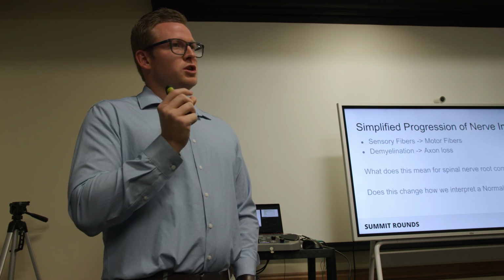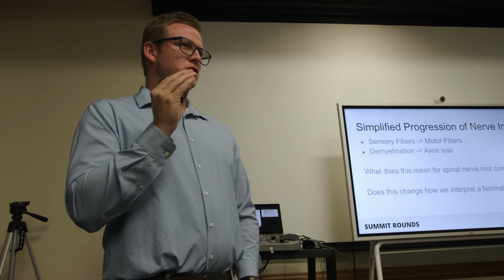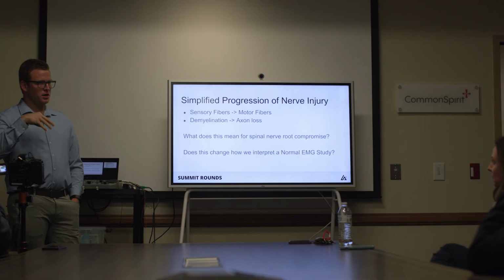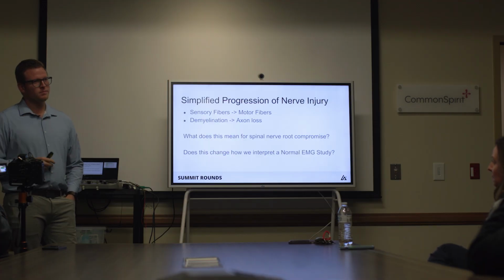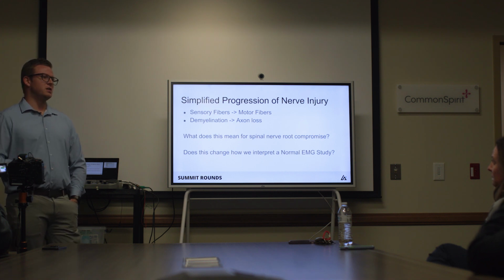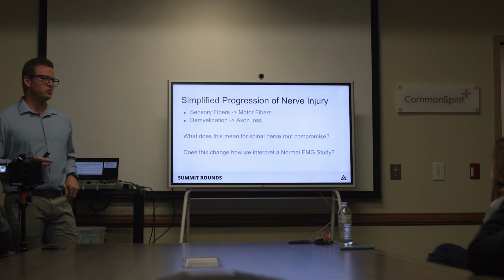Yeah, especially the EMG portion. Those electrical signals that we're looking for aren't going to show up until a few weeks have passed, where you get the Wallerian degeneration and the change in the muscle membrane. So yes, timing of the EMG is certainly important. Usually by the time a patient comes in, they're worked up, you order an EMG, they schedule it and come for that appointment, it's been 3 weeks. It's pretty unusual that they would beat that timing anyway.